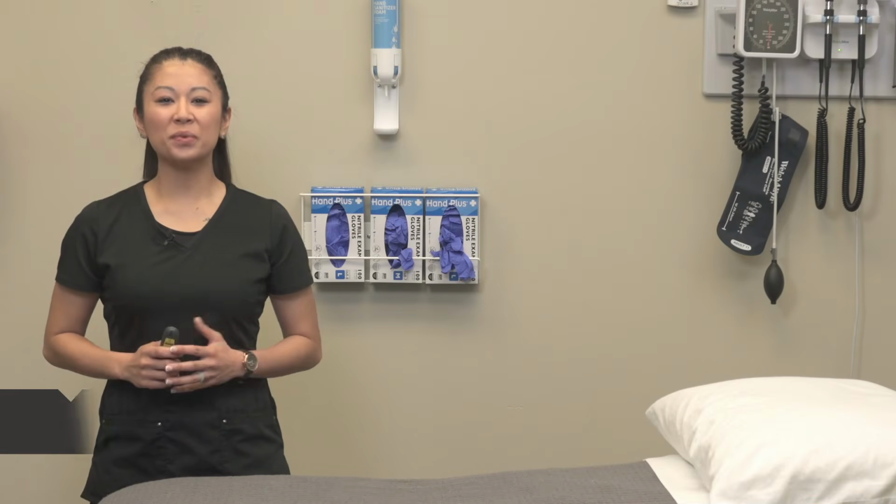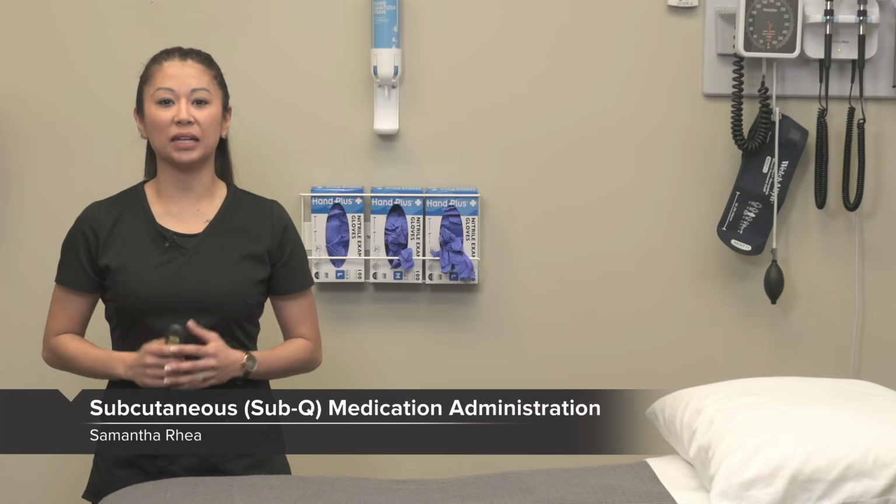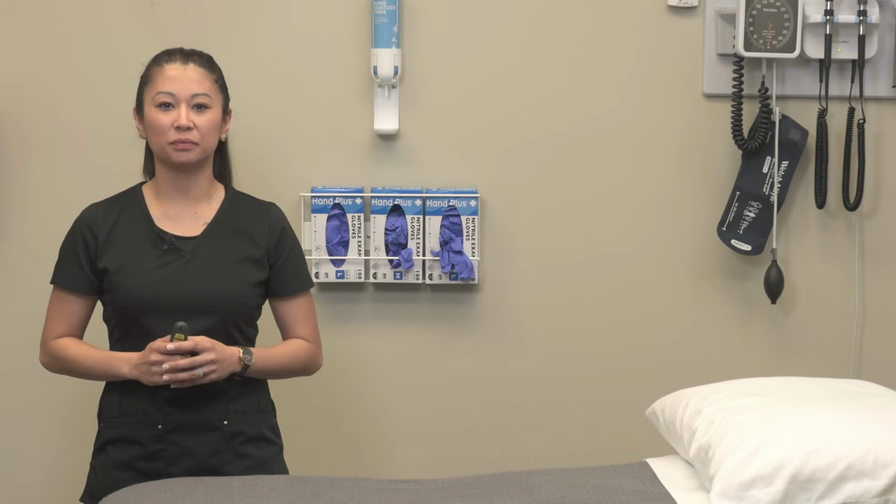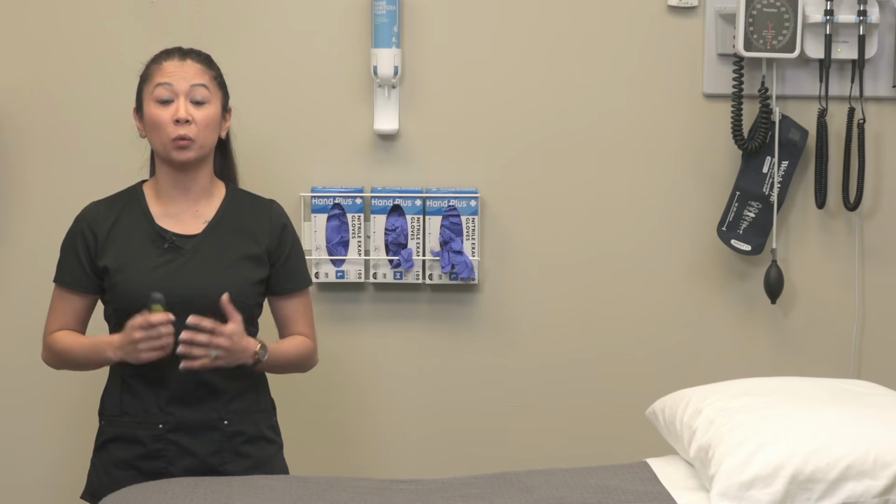Hey guys, welcome to the skill subcutaneous medication administration, otherwise known as subq, which is commonly called. Now let's take a look at the equipment we're going to need.